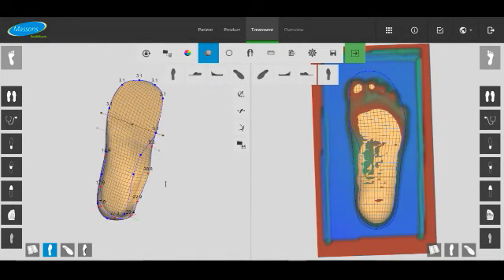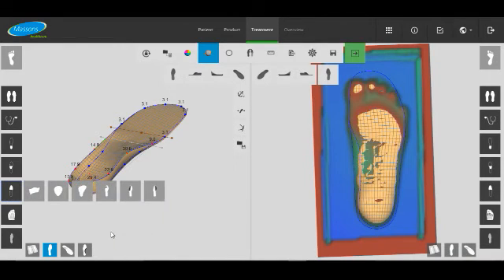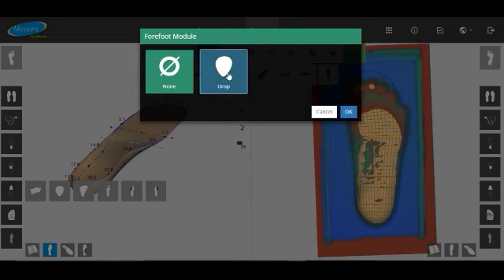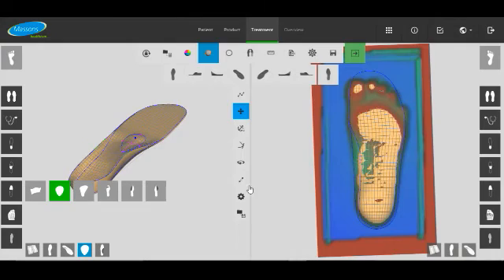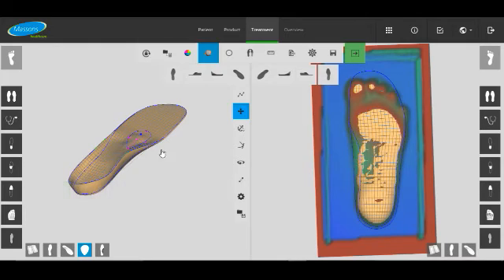We'll put the metdome in now. So we'll head over to the forefoot modifications. Let's just select metdome. We'll make it unusually high. We'll probably set it around 10mm, just to make it really obvious.